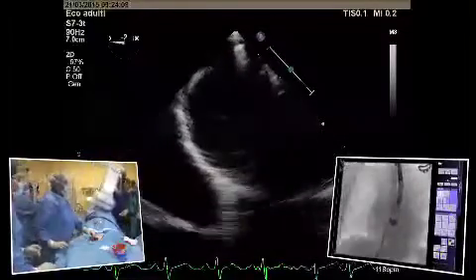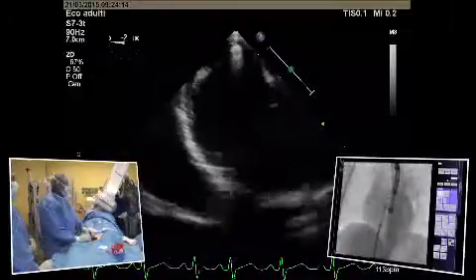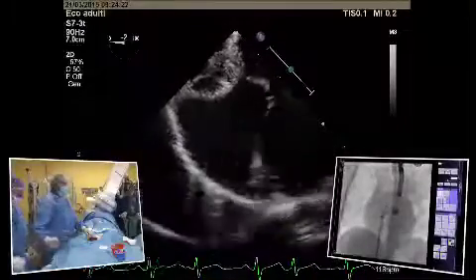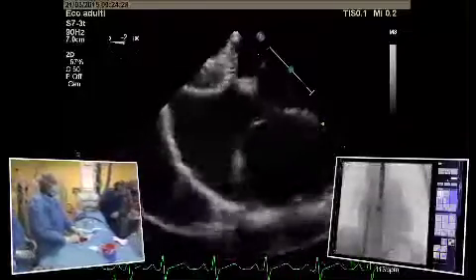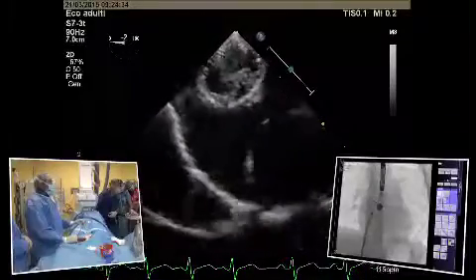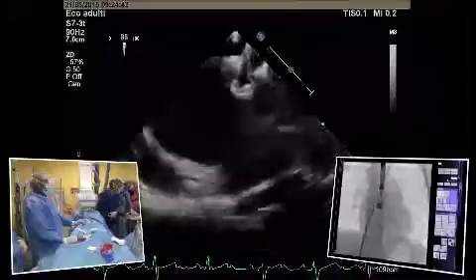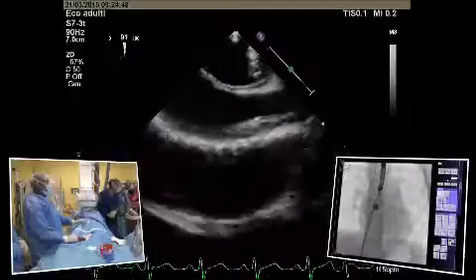Mario, you have one of the greatest imaging persons in the lab, but do you have one of our colleagues in imaging helping you while driving a device? Well, actually, let's go in AP because Aki, we don't want to hit. It's okay. So you rotated it to the right. But Aki, we see the device on fast. Can you go to short axis or bicaval or something like this? You see the device is perpendicular to the septum, so we don't like this position.